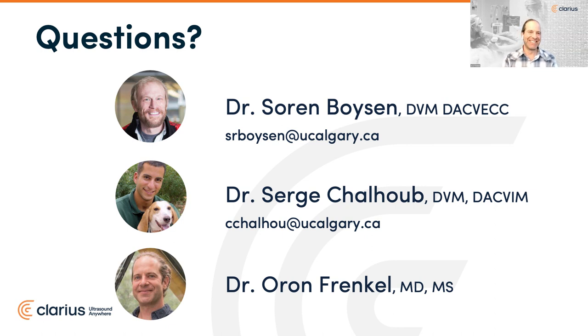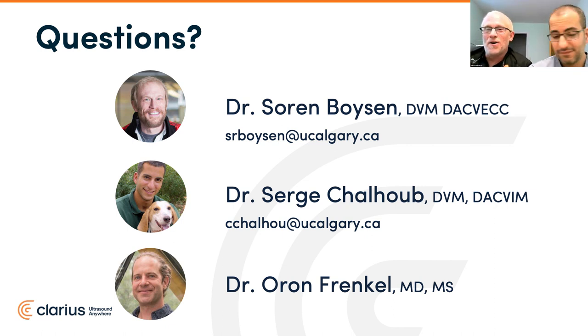Well, and I will also say that if you want to know what I think is the best way to actually get proficient at it, it's to attend a hands-on session in addition to the lectures. The lectures are great, but then it's going to be attending a hands-on session to get an exact feel for where you are. And then, like Sir said, you got to start scanning everything you can get your hands on. And don't wait for the sick patients to scan. Scan the normal patients. Start with the abdomen. Get comfortable with yes and no. There's no effusion or anything. And then move on to the pleural space and lung and then do the heart.